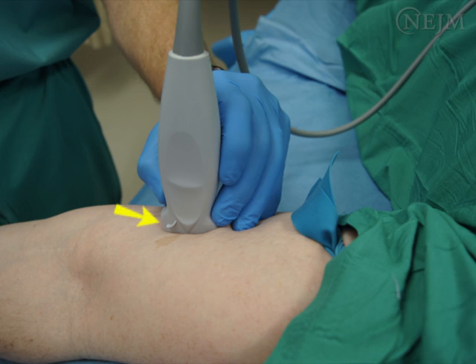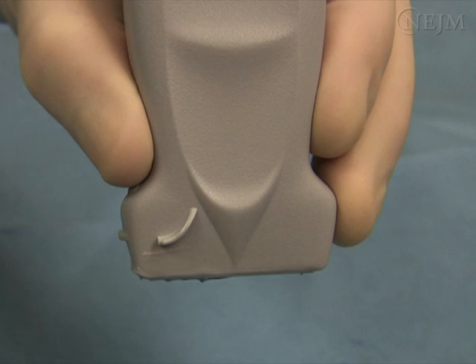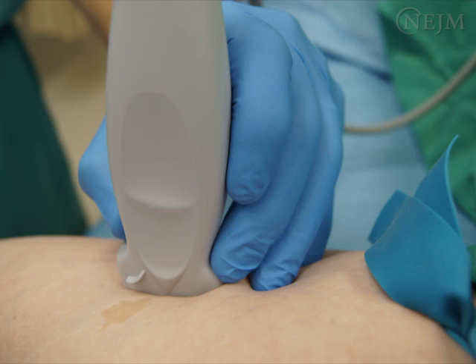The transducer indicator can be aimed proximally or distally, depending on personal preference. However, it is crucial to know which side of the image represents the distal vein, because that is where the needle will enter the image. Hold the transducer with your thumb, index finger, and middle finger. Place your other fingers on the patient's skin so you can hold the transducer completely motionless during the procedure.